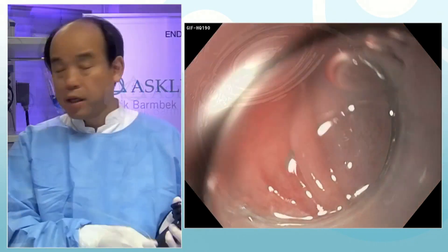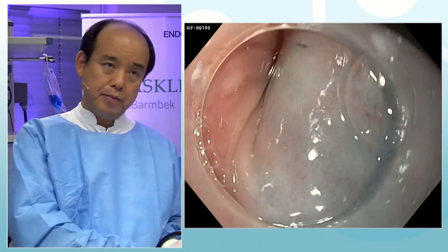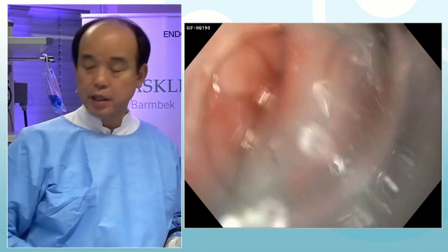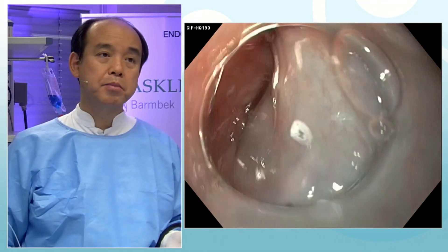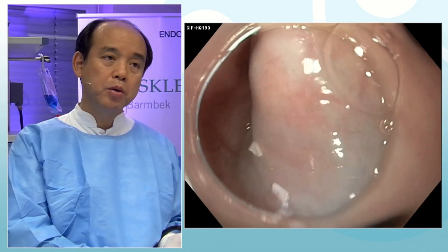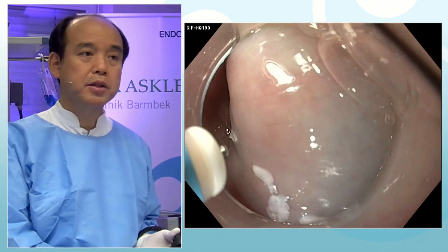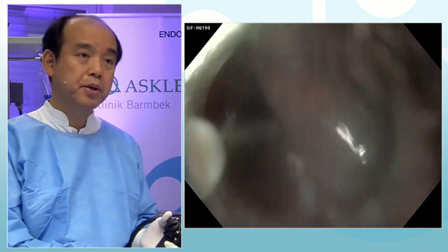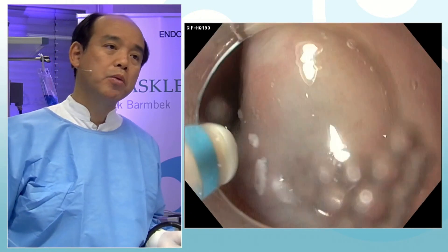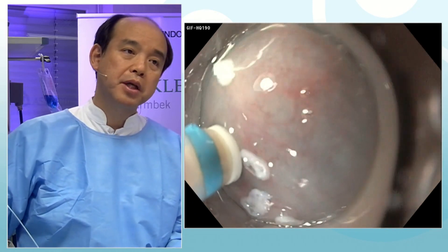I'm going to make a mucosal incision using a brand new electric current called Blend Cut. This is very similar to the dry cut mode of the ERBE system. Open it please, and check the injection capability by pressing the foot pedal. Now we can see the blue band and white ceramic tip.